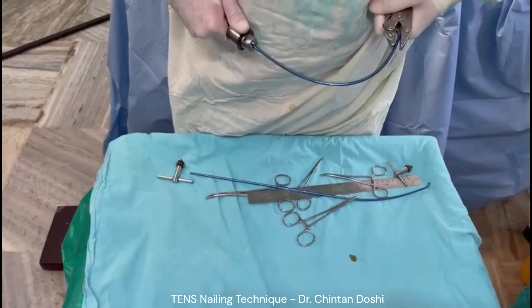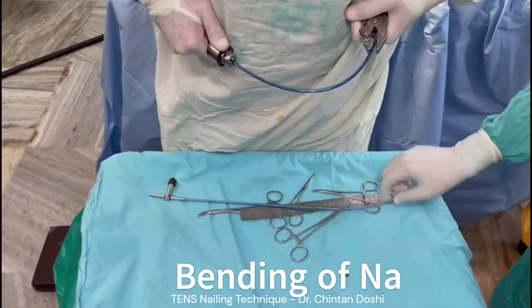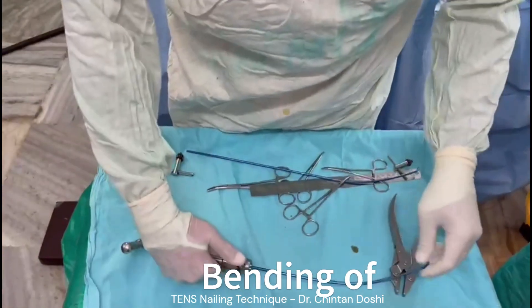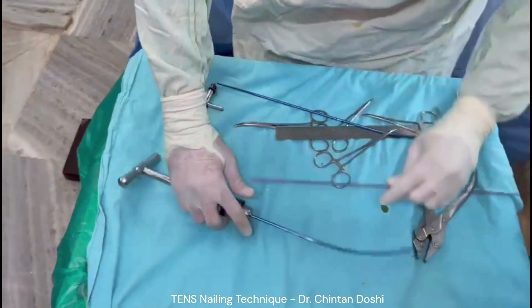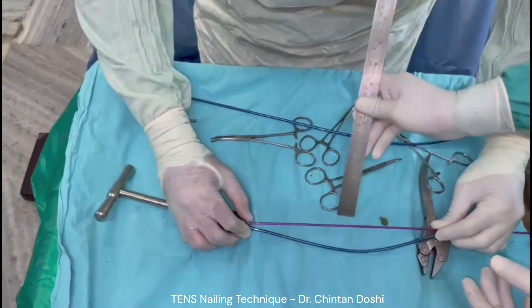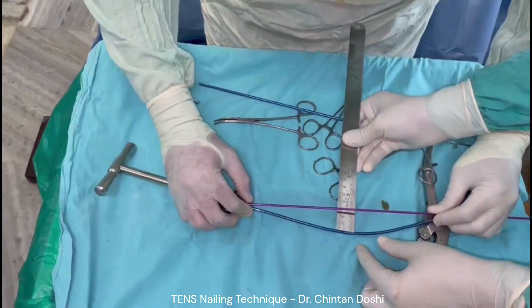Bending of the nail is achieved as shown. It is uniformly done by holding the tip in the plier while the T-handle is kept at the side of the entry point on the nail. The maximum height of the curve should be at the level of the fracture site and should be three times the intramedullary diameter.